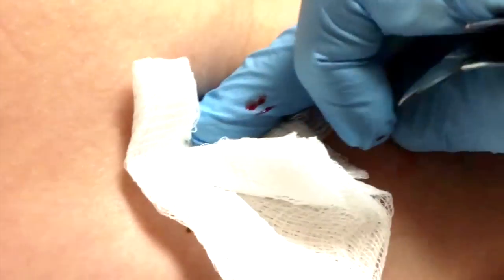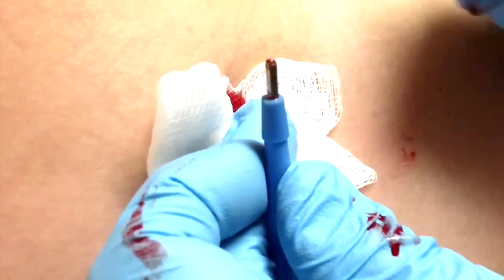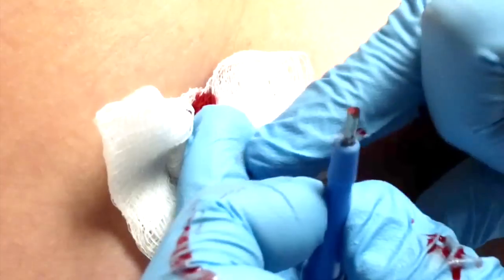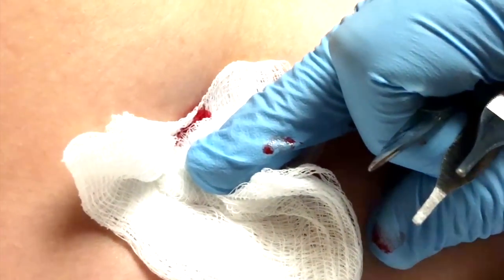Because it's so small, it came out — yes, it did — it came out in my little punch biopsy here. So we'll put that into a little formalin and send it for biopsy, then put a suture in here.